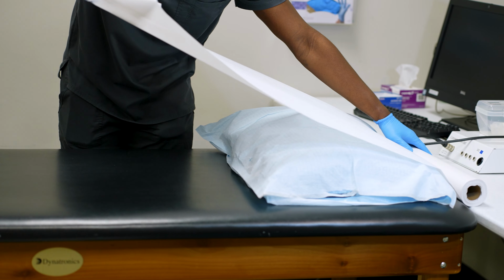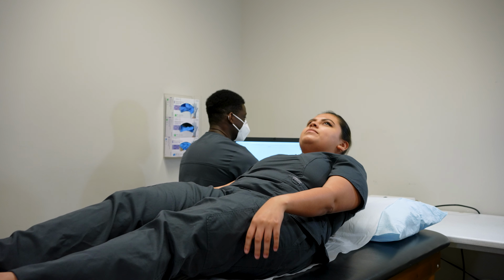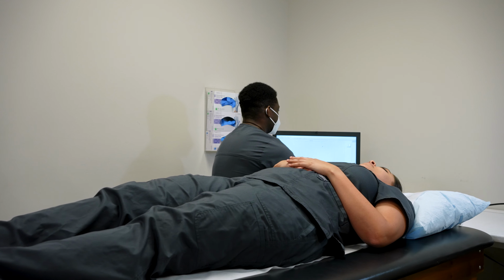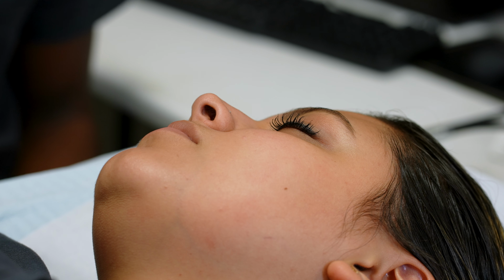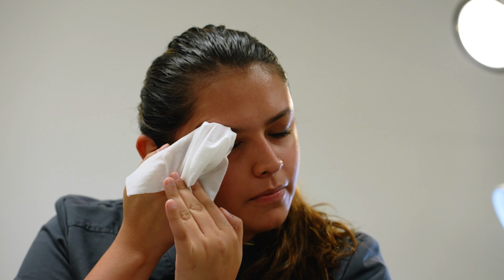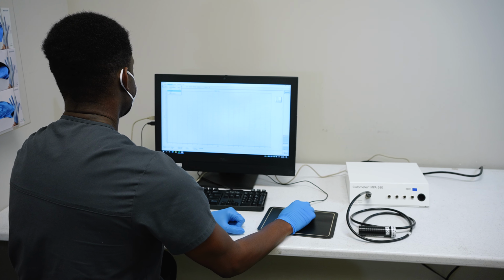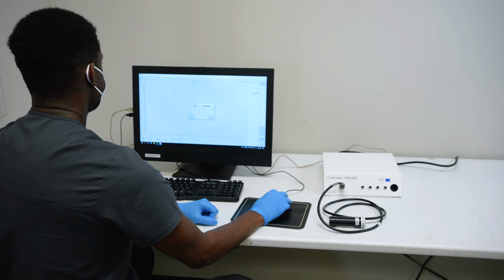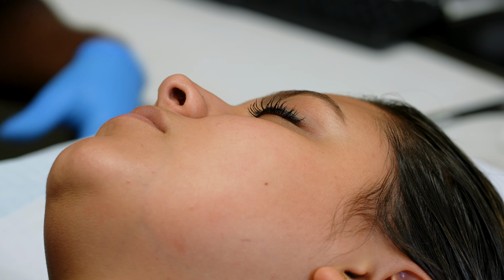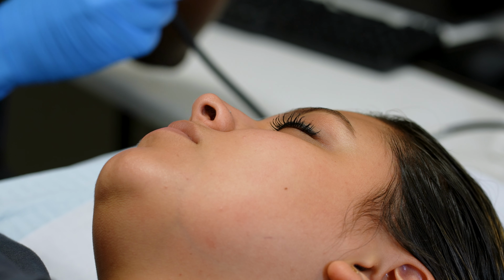For operating Cutometer, have the subject lay flat on their back with a piece of exam table paper covering all contact points between the subject and the massage table. Make sure the desired test site is free of any debris, for example makeup, visible dirt, etc. Isopropyl alcohol and/or makeup removing wipes may be used to ensure a clean and accurate measurement. If a cleanser of any sort is used on the test site, ensure the site is dry before performing the instrumentation.